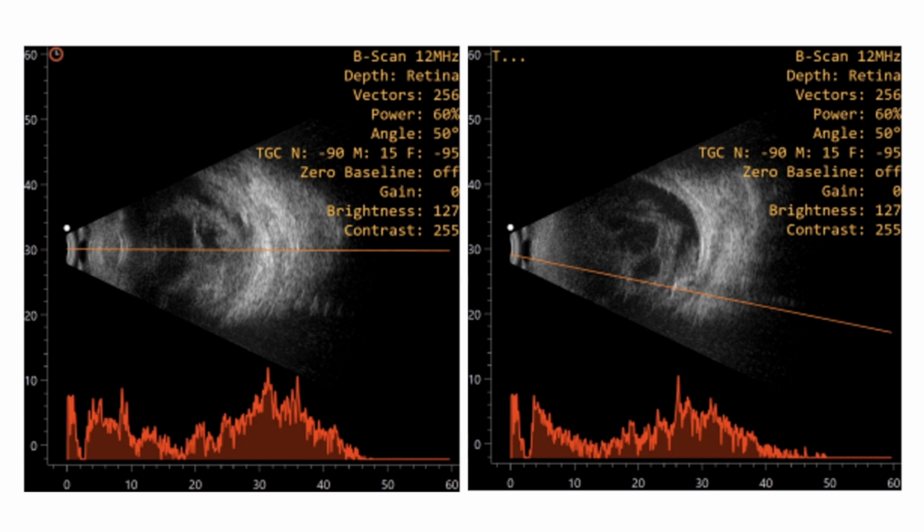Choroidal detachment. Okay, fine. What else do you want to look for? You're anyway going to operate, right? So in pre-operative planning, what do you want to know?